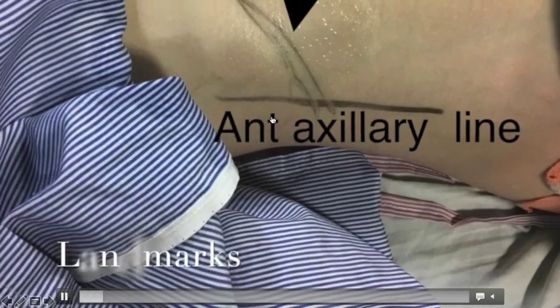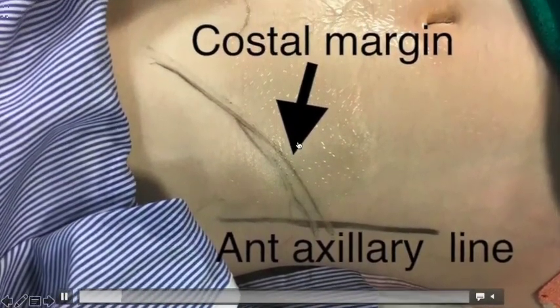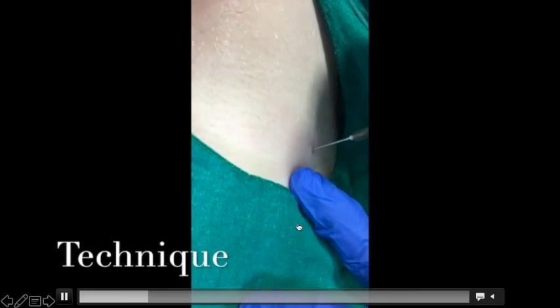Again here I have drawn the anterior axillary line. This is the costal margin, and 2 to 3 centimeters medial to the anterior axillary line is the needle insertion point. This is a blunt tip needle.